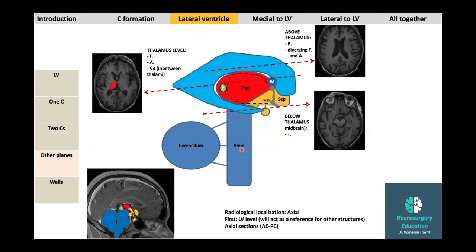So you want to identify these structures on MRI. So you have an axial cut. This axial cut passing through the thalamus. So it passes which horns? Anterior and posterior to the thalamus. Which horns? Anterior, the frontal horn. Yes, and posterior? The atrium and the posterior horn. Exactly, atrium and occipital horn. So here is the thalamus, and the frontal horn is here, and the atrium is here.